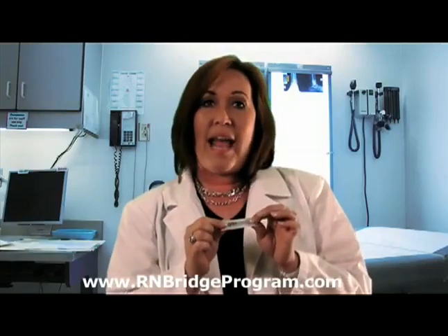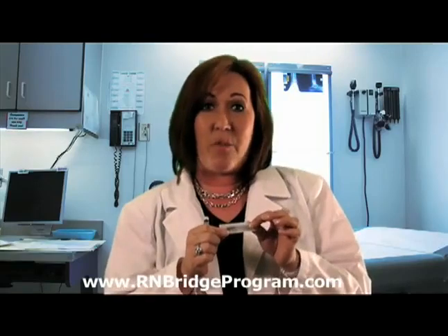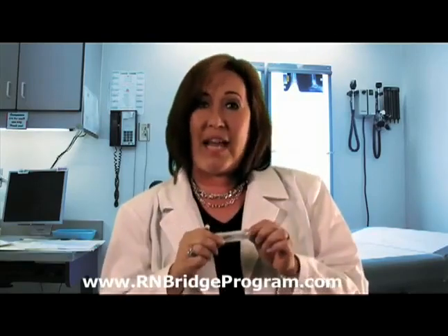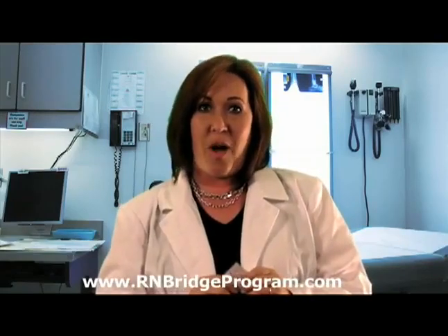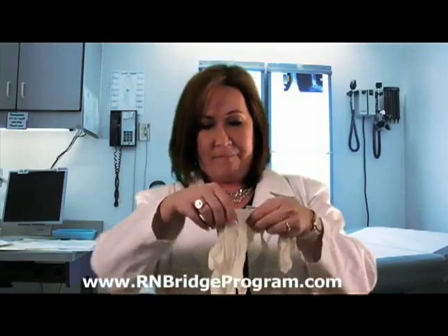We do a 1.5 inch so we get deep into that muscle because it is an intramuscular injection, so we don't want to actually get into the subcutaneous tissue. We need deep into the muscle, and the 1.5 inch is the most appropriate for this site. And then you need your alcohol swab. So let's go ahead and let's put our gloves on.